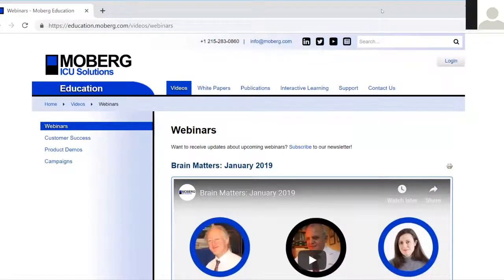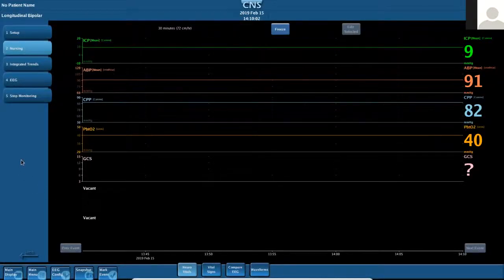So I'm going to do now a new share. What Kathy and I thought we would talk about today is how to edit not only just displays within your protocol, but to actually edit a protocol. So to change things as you need to, potentially for an individual patient, but then more often if you want to add a new protocol to your hospital, if you want to have a new way to actually look at information. So let's start basic.